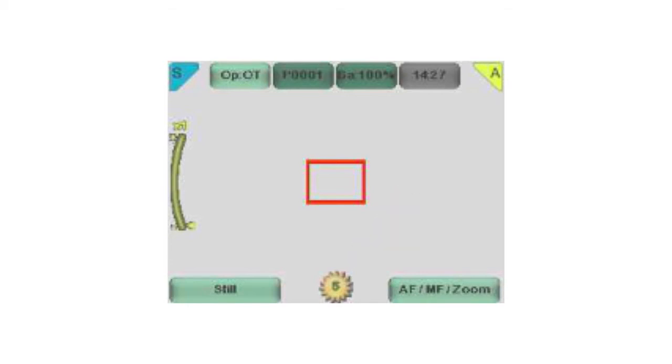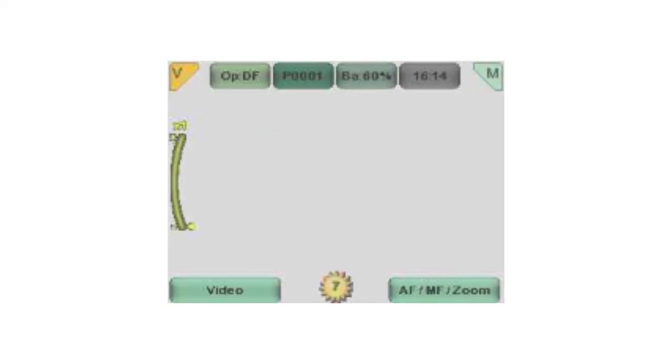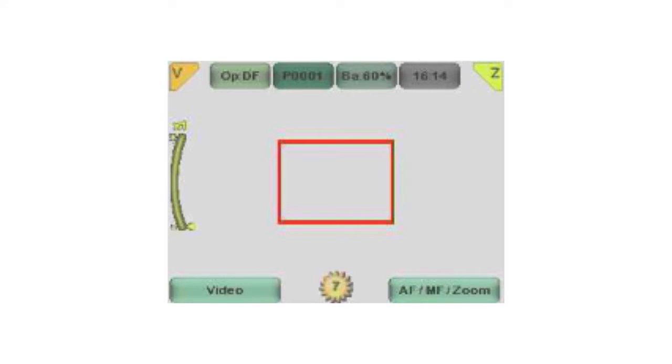The focus mode can be switched by short pressing the right soft key. The icon in the top right corner of the screen indicates the selection. M indicates manual focus, A autofocus, and Z zoom.